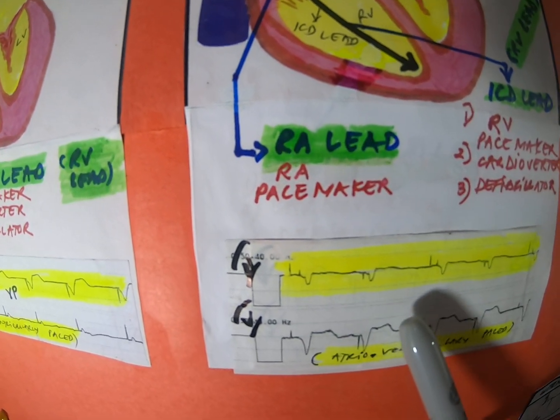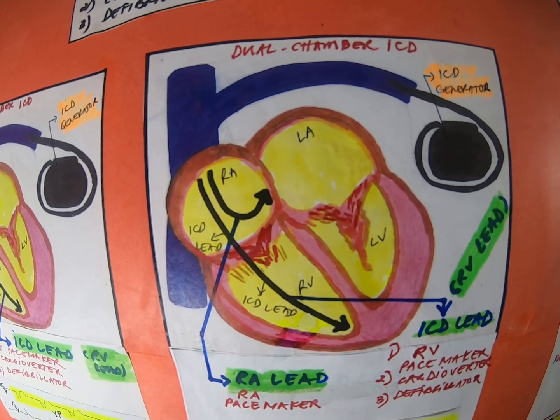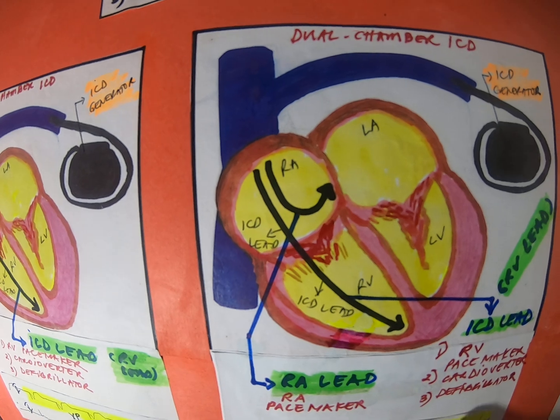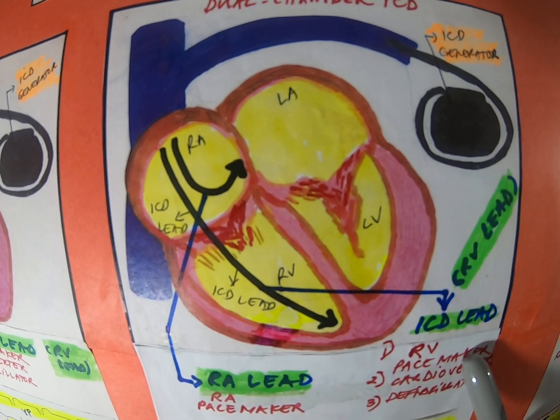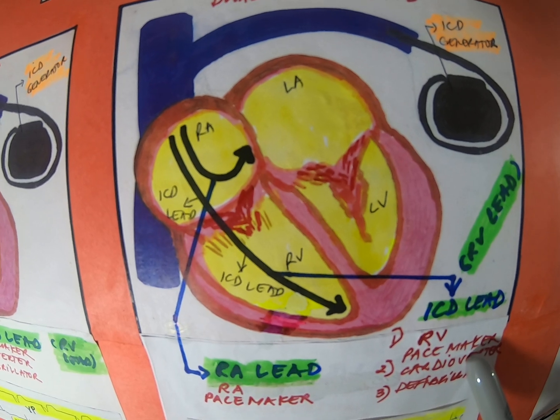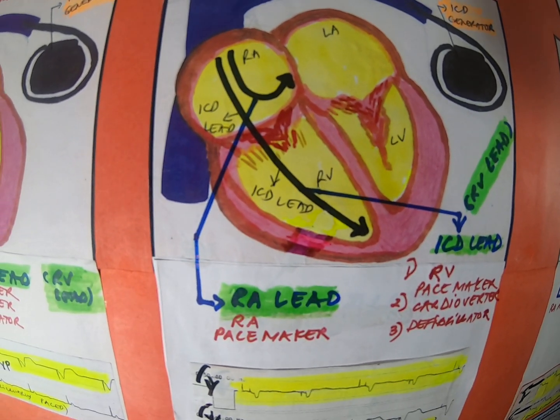Okay, and we have here a strip, and this is an atrioventricularly paced rhythm, and it is used for VTAC, with or without pulse. Okay, bradyarrhythmias because we have a pacemaker, and also for tachyarrhythmias, the anti-tachycardia pacing will kick in, hoping that it might solve the problem. If not, if with pulse, the VTAC, then sync cardioversion. If it is without pulse, then direct defibrillation.